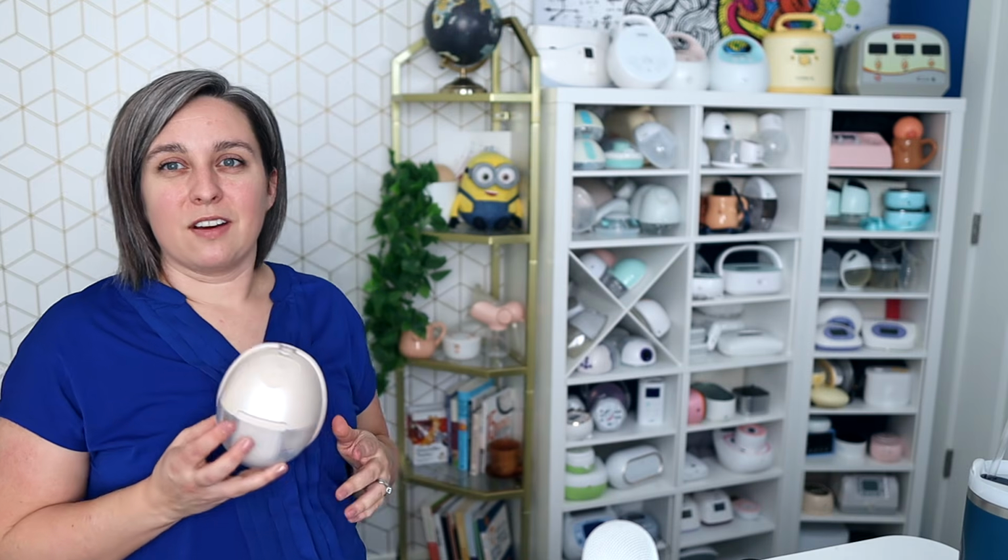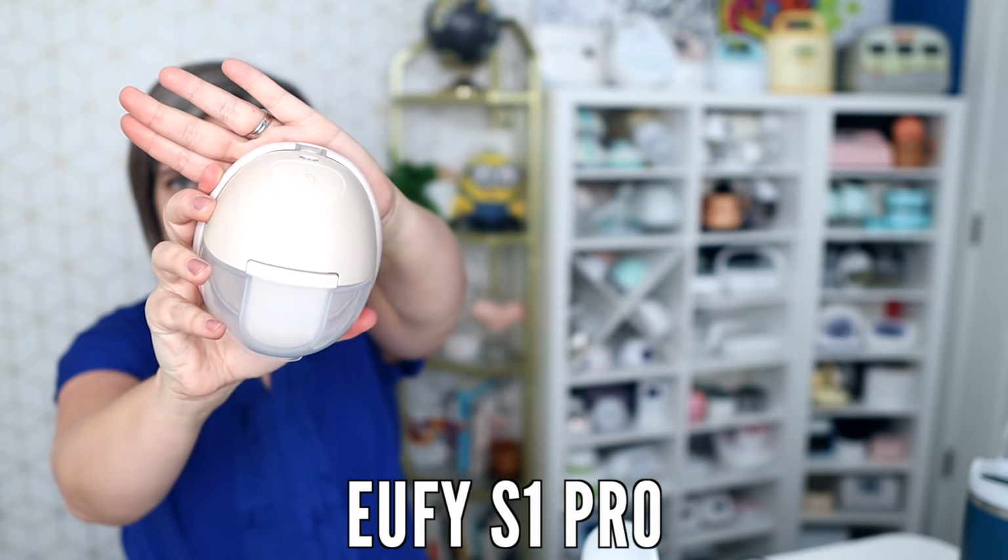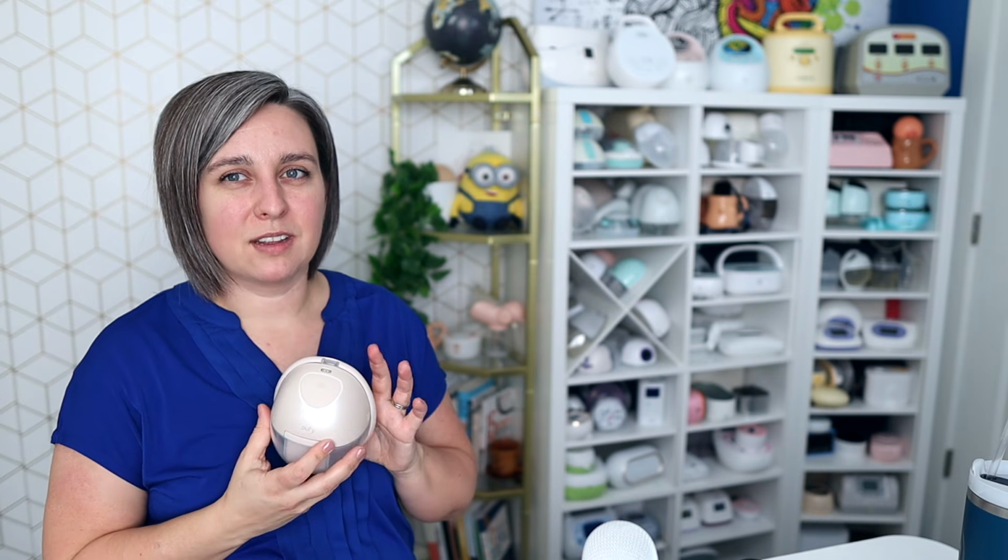I also tend to like pumps that give you a few options for suction patterns, different things to try, different modes. We are seeing quite a few of the wearable pumps right now start putting in these mixed modes, which I think is really smart on a wearable pump just because of how it's used. Actually, I did a video recently on this Eufy pump. It's a wearable pump. They actually have 4 different patterns that you can do. And it kind of is between stimulation and expression mode. So it's not necessarily like the pattern, which I guess is what we're talking about. So maybe this doesn't apply, but I like that they gave you different options for programming, that you could go between stimulation and expression mode in different lengths and at different time intervals. That was really interesting.